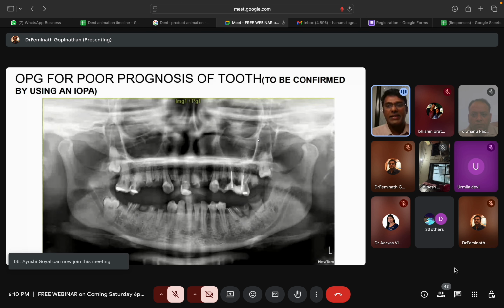Now in this condition, upper is a full mouth case. Lower can be segmented on both the posteriors of the left and the right lower teeth. Retaining that first, you can try to retain the teeth from right first premolar to the left second premolar. But when you decide on this, there are a few things which have to go through your mind.